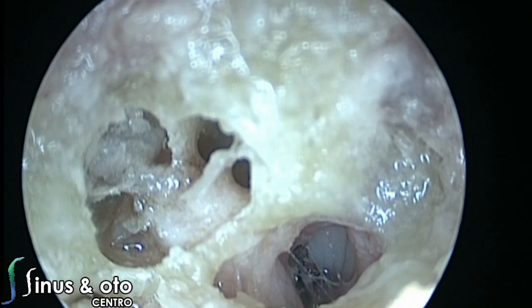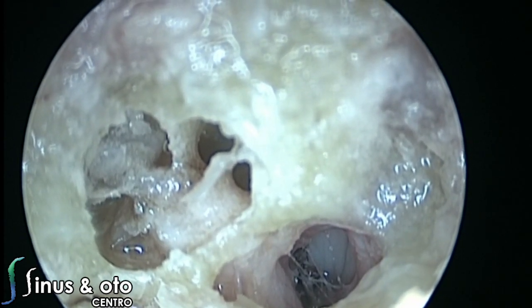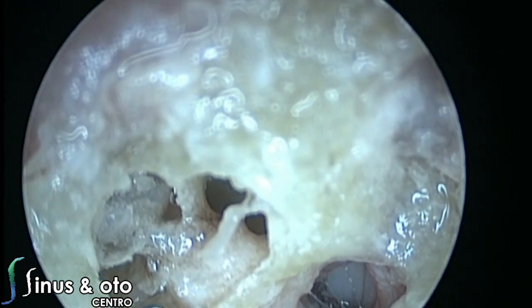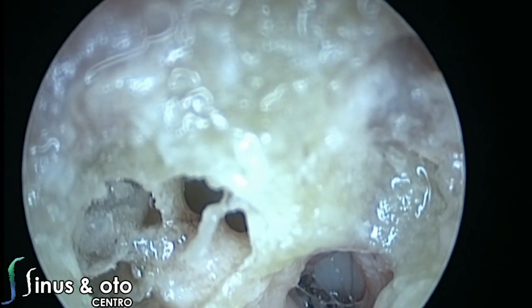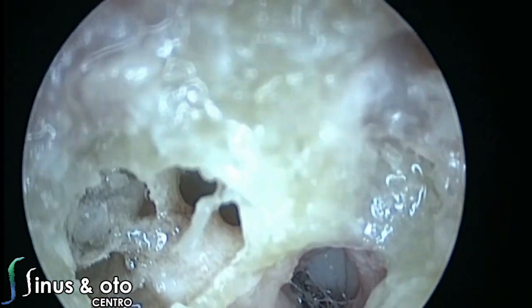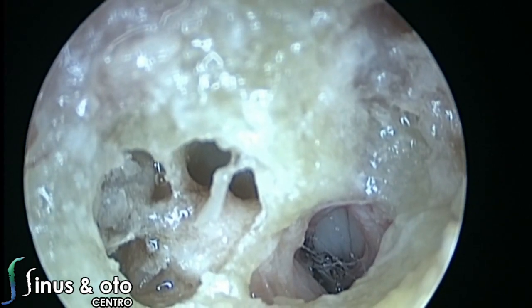Because one thing is the macroscopic anatomy. Another thing, although they are the same structures, can be the microscopic anatomy. And another different thing, although it's the same structures, can be the endoscopic anatomy. So you have the macroscopic, microscopic, and endoscopic anatomy. And also, depending on the approach that you do, the structures can be different.